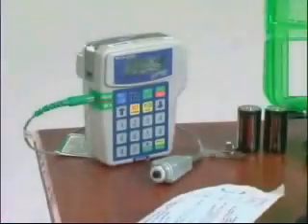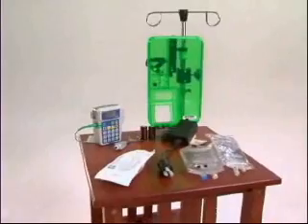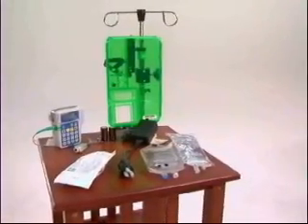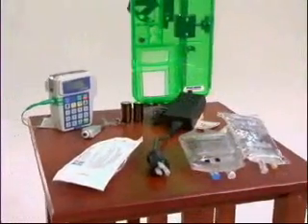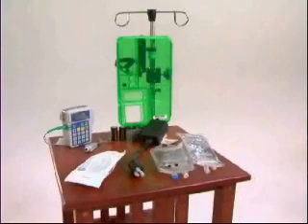This is the Curlin 4000 CMS, which is an ambulatory infusion system that you will be utilizing in administering IV therapy. The device has five therapy modes: continuous, PCA, TPN, intermittent, and variable. We will be using PCA therapy, continuous therapy, and TPN therapy for this in-service. The pump is small and very easy to use.